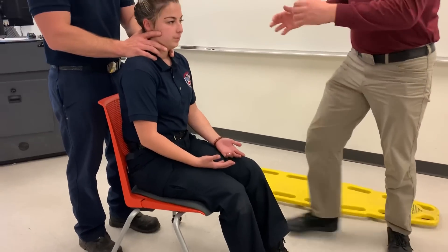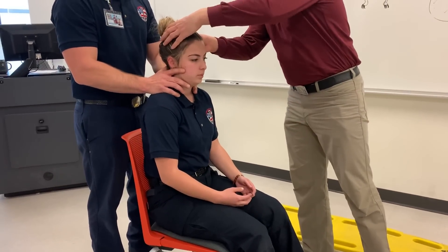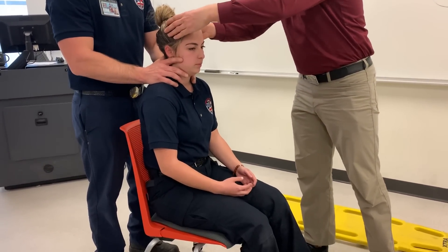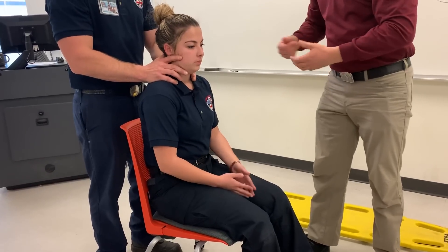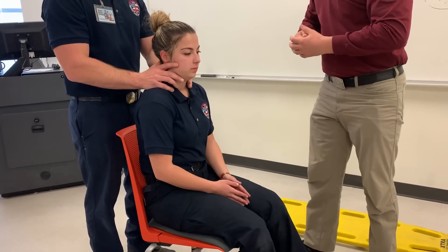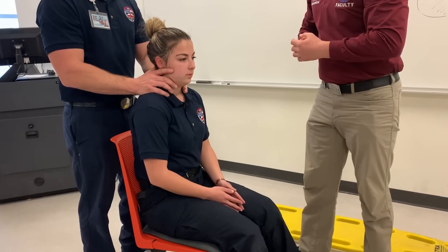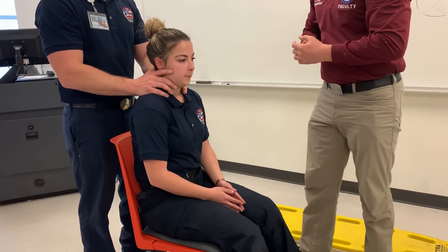Now I'm going to assess all the areas. Starting at the head, I'm looking for DCAP-BTLS and blood on gloves — that's deformities, contusions, abrasions, punctures, penetrations, burns, lacerations, swelling.